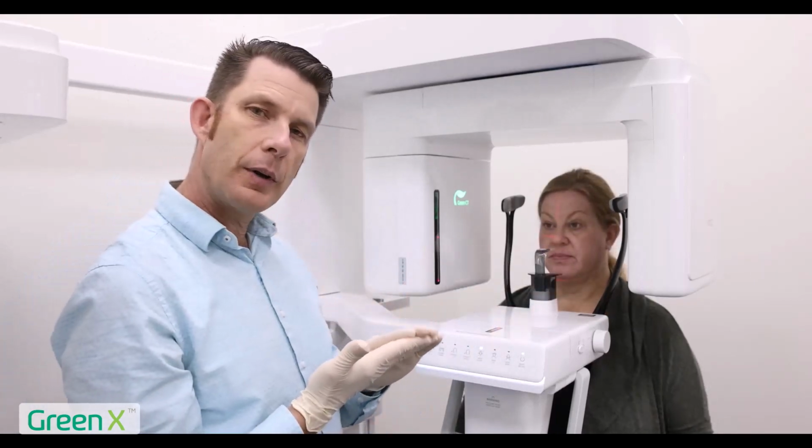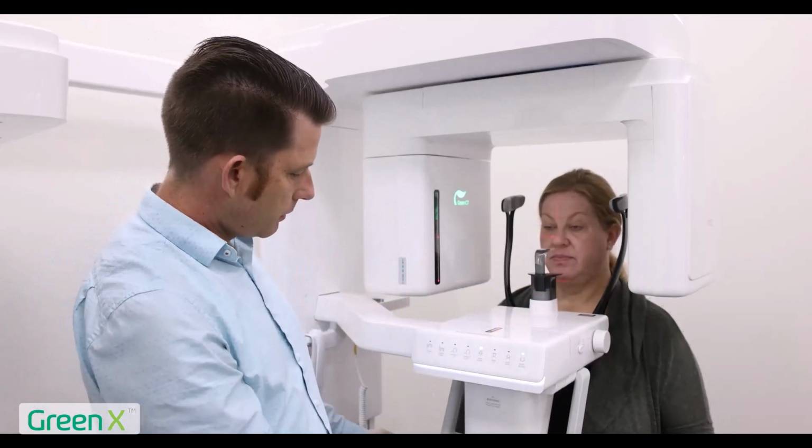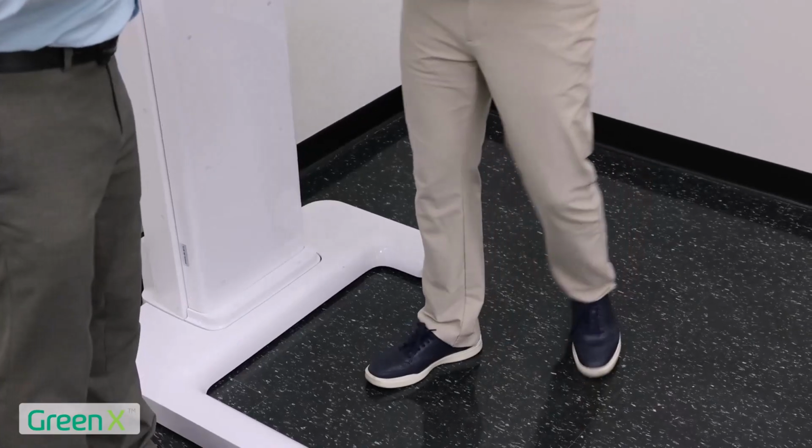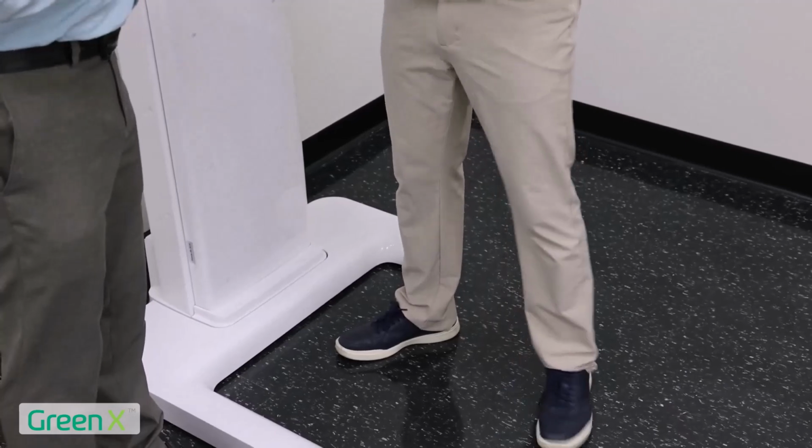A couple things to start with for patient positioning. I'm going to start with the hands. Go ahead and place hands palm facing up. Go ahead and walk forward, feet shoulder length apart. Then I'm going to have the patient bite on the bite stick.